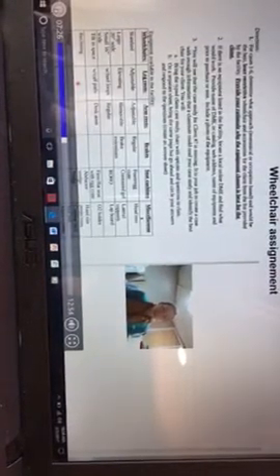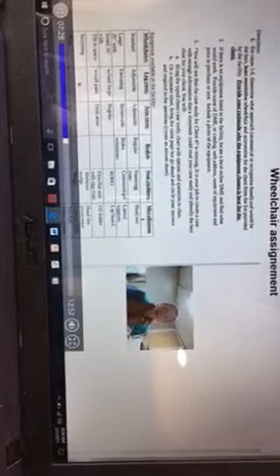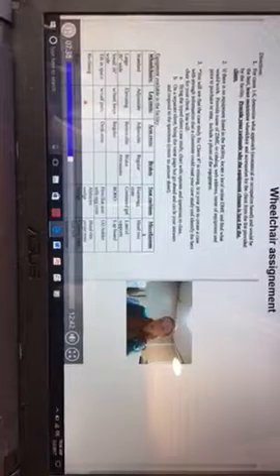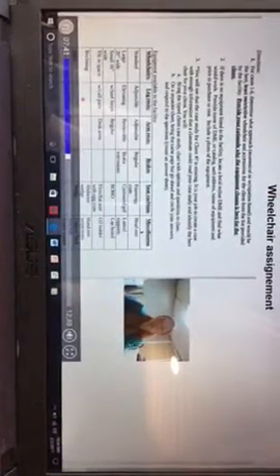The downside is with gel, you have to move the gel a lot of times, and so if you have somebody who is a fairly dependent person and needs a lot of assistance, they would not be able to move that gel themselves, and would need a caregiver to do that.